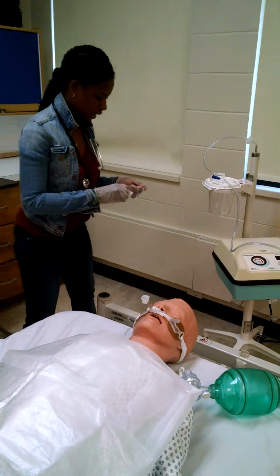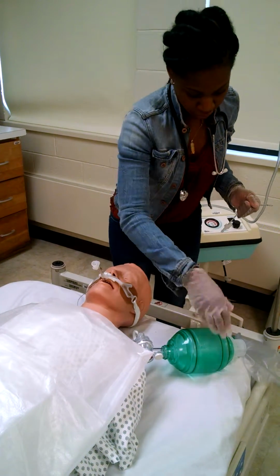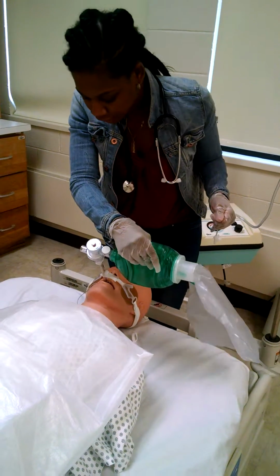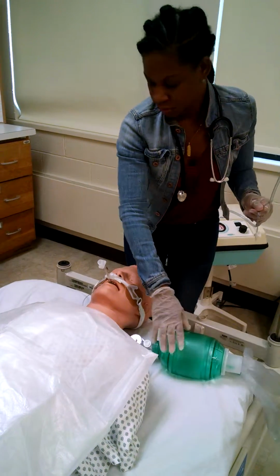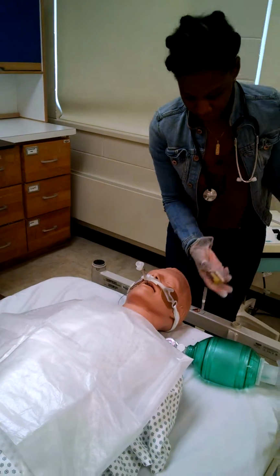Okay, first I'm going to hyperventilate the patient. And check for CO2. I didn't check for the CO2, so I'm going to go ahead and do that now.